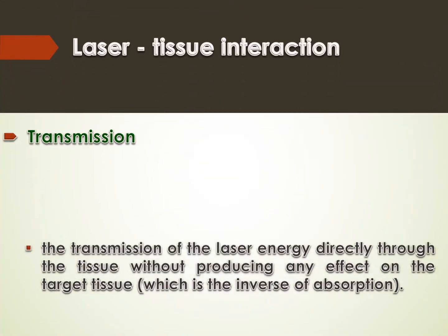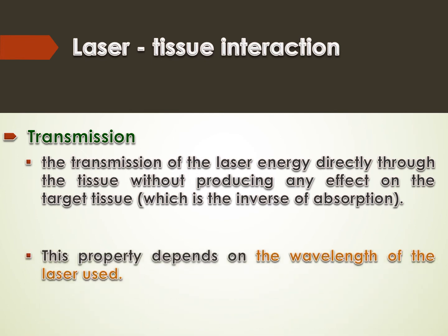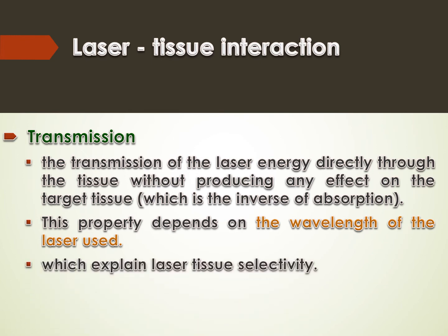Transmission. The transmission of the laser energy directly through the tissue without producing any effect on the target tissue, which is the inverse of absorption. This property depends on the wavelength of the laser used, which explains the laser tissue selectivity.